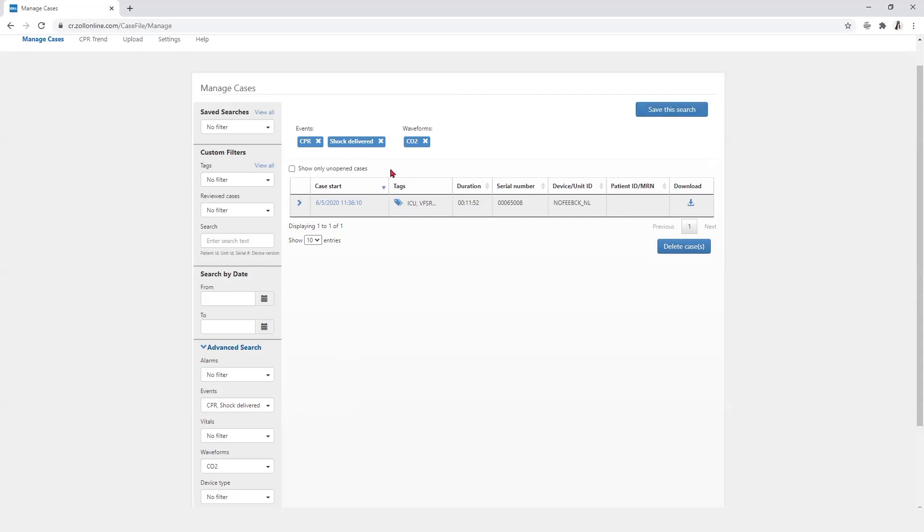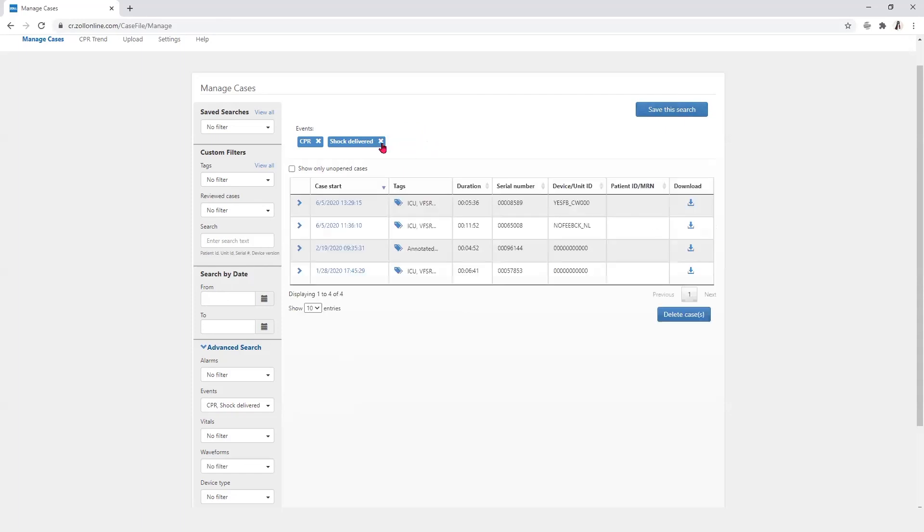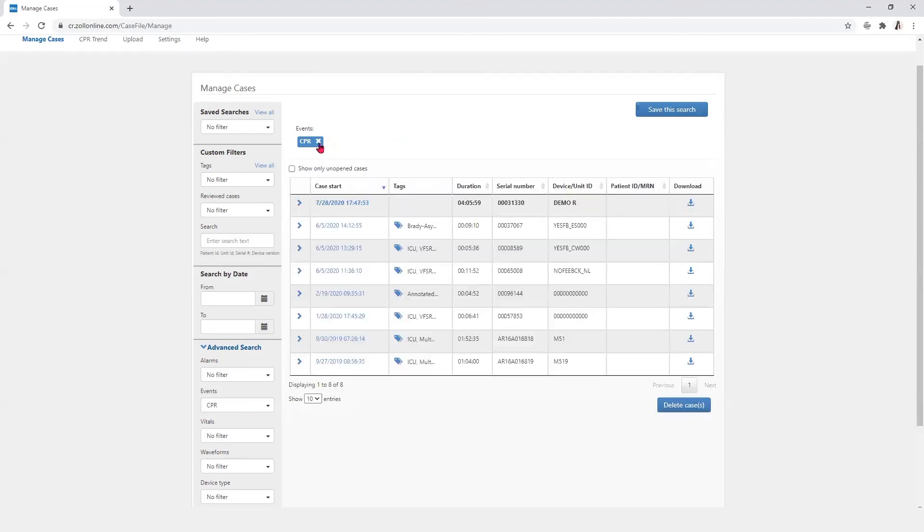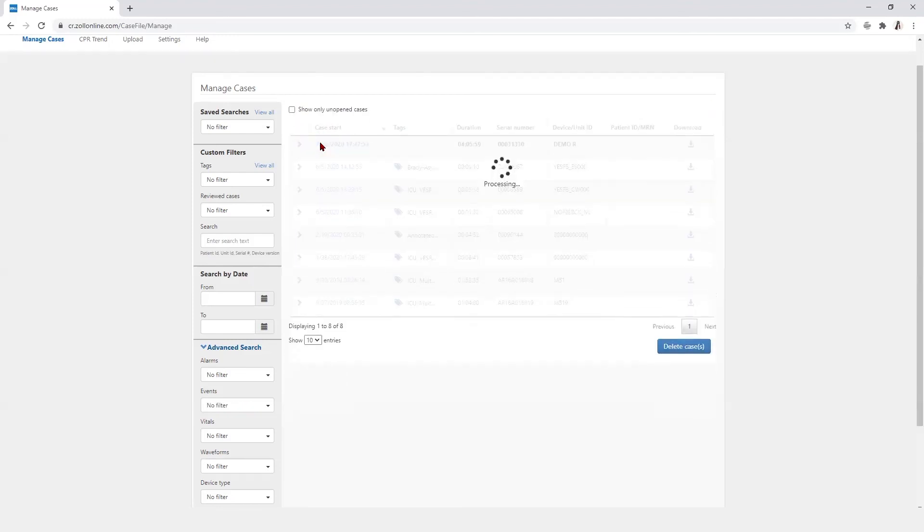To remove any search features, simply select the X next to that particular attribute.